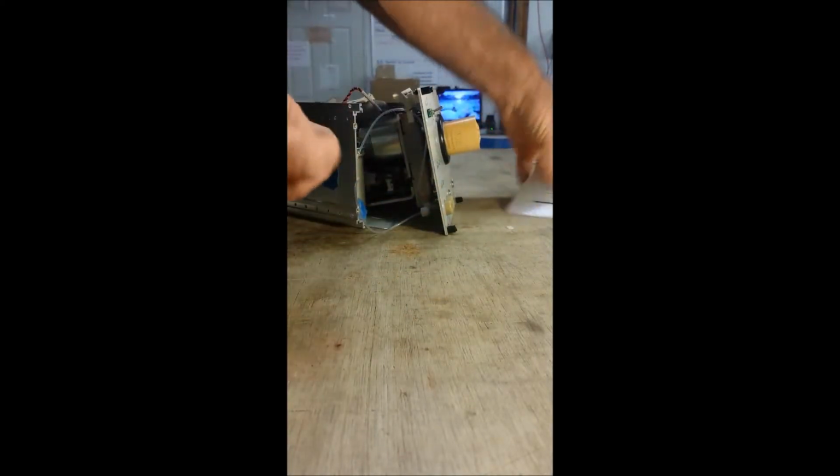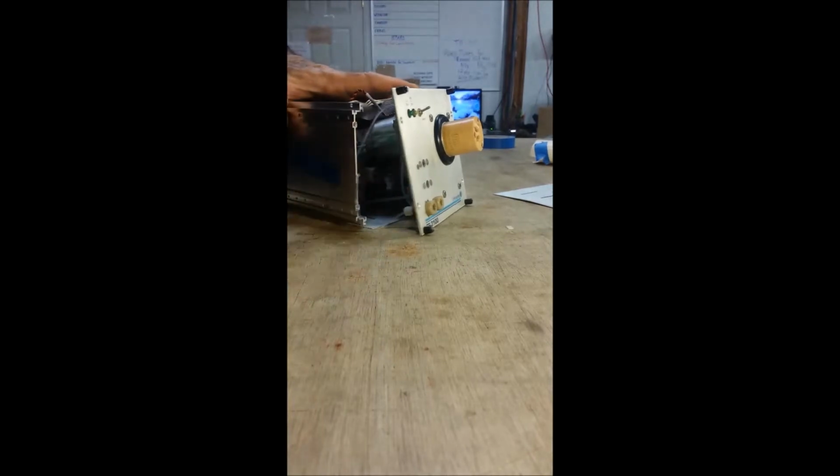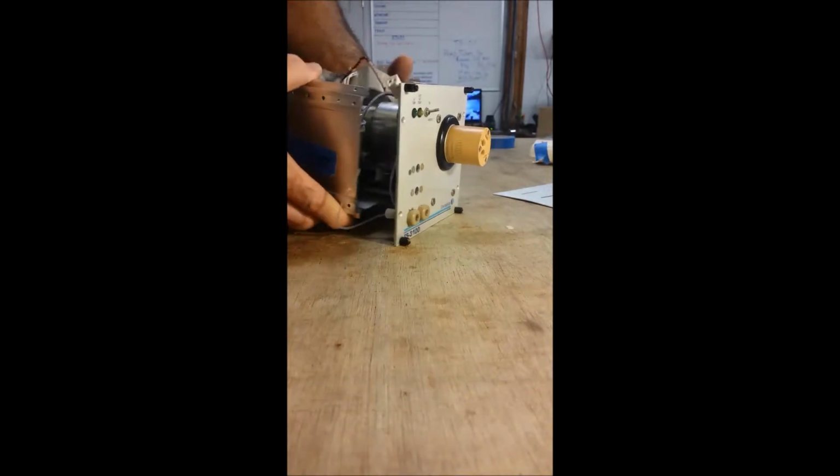Now there is a top plate that I don't actually normally put back on. It's not really necessary, so you can put it back on if you want. It's just a little more work to get both of these plates in.